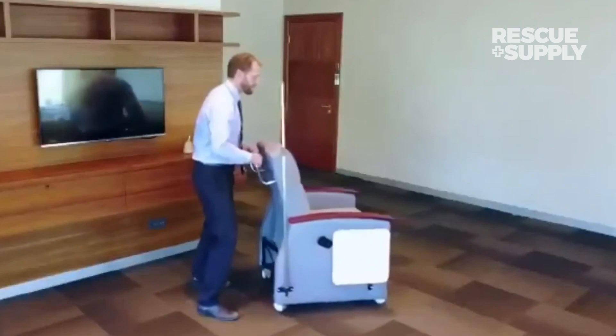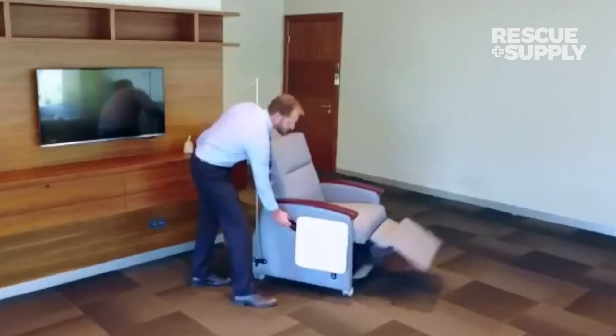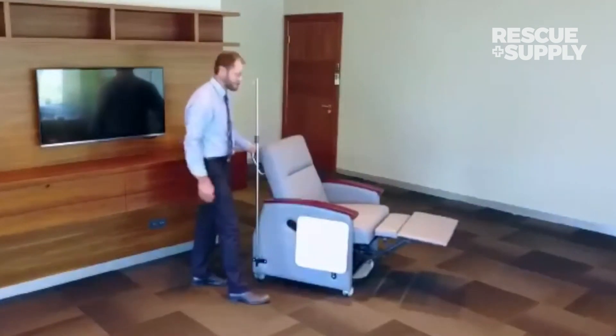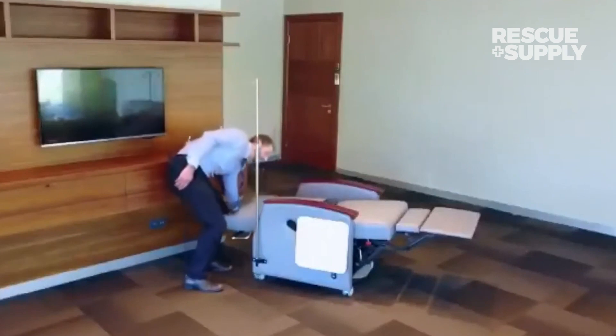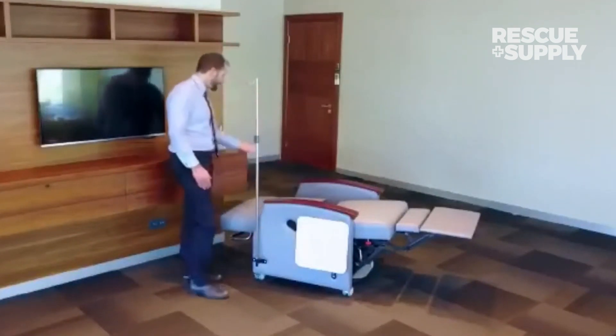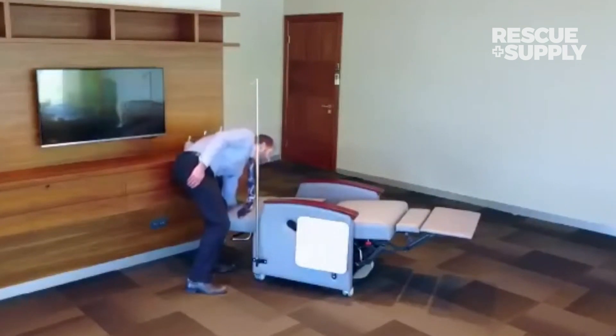Just going through the positions here: TV position — simply lift and pull out. Recline position. And Trendelenburg. You can see how easy it is and how close you can get to a wall. Those are some of the key features.